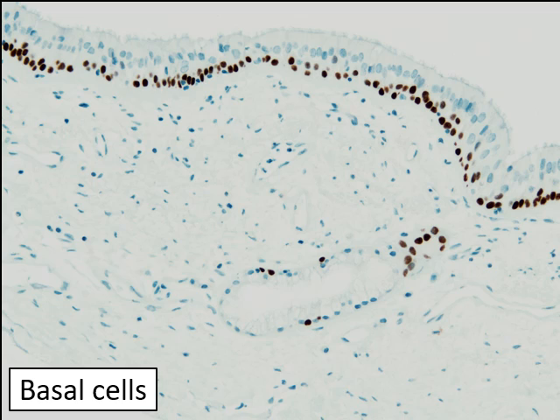Basal cells are located at the base of the epithelium, just above the basement membrane. They are difficult to see on H&E sections because their nuclei are indistinguishable from those of ciliated columnar cells due to crowding. A p40 or p63 immunohistochemical stain colors the nuclei of basal cells brown, revealing how many there are. These cells are thought to be progenitor cells and are associated with squamous cell carcinoma of the lung.